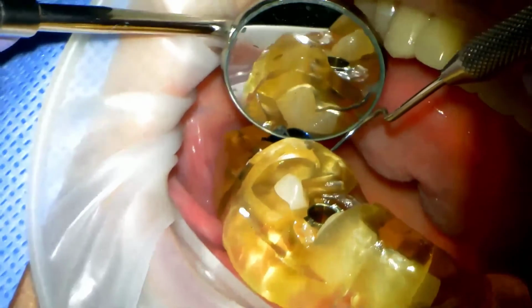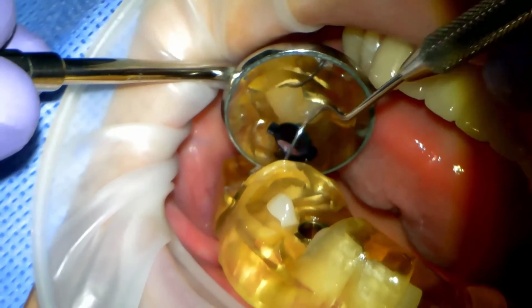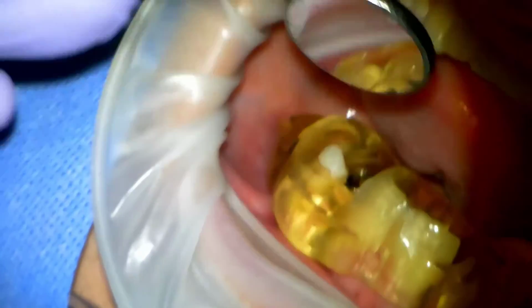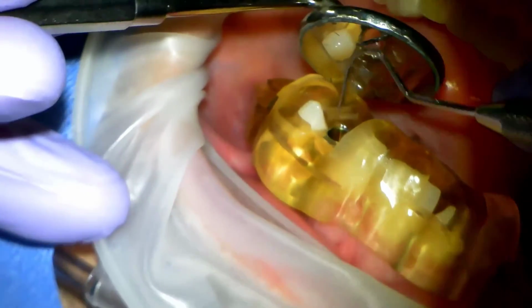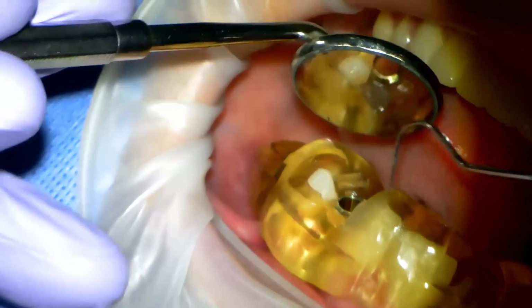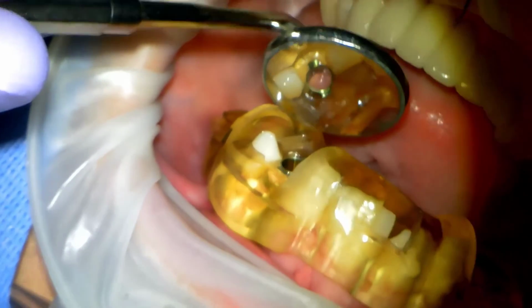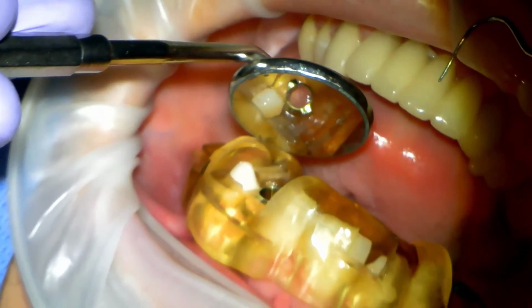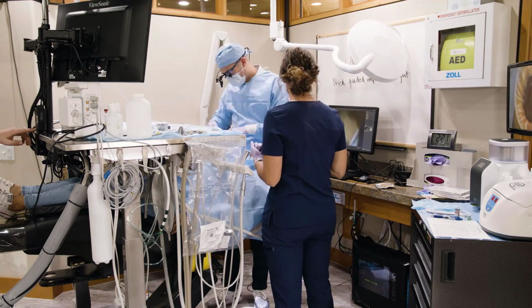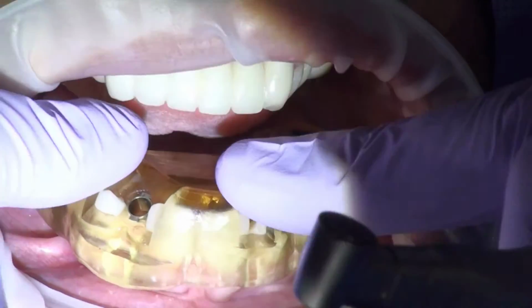Beautiful. That right there is beautiful. That could belong in a textbook. Look at that. Beautiful fitting guide. No rocking or anything. Where we're going to focus right now is in this site. The fact that I see a gold sleeve means that this is a narrow implant site. The other ones are blue, blue, and so here at gold is a narrow implant site. So I love that. That fits beautiful. Okay, so I love the way the guide fits.